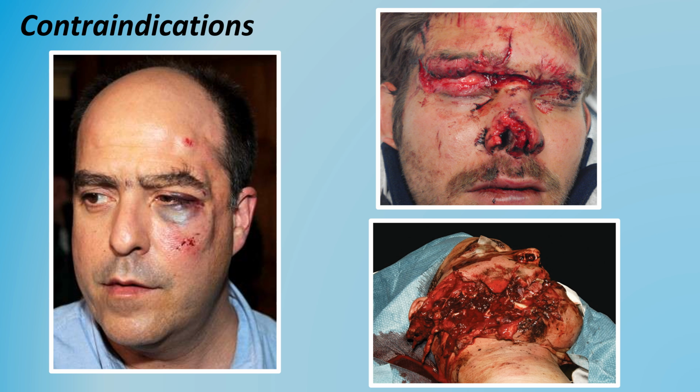This is just going to be an absolute no. There's no way that the CPAP is going to fit on this patient. There's no way that we can guarantee that this patient's airway has not been injured. We are likely to cause further damage to this patient applying CPAP to them.